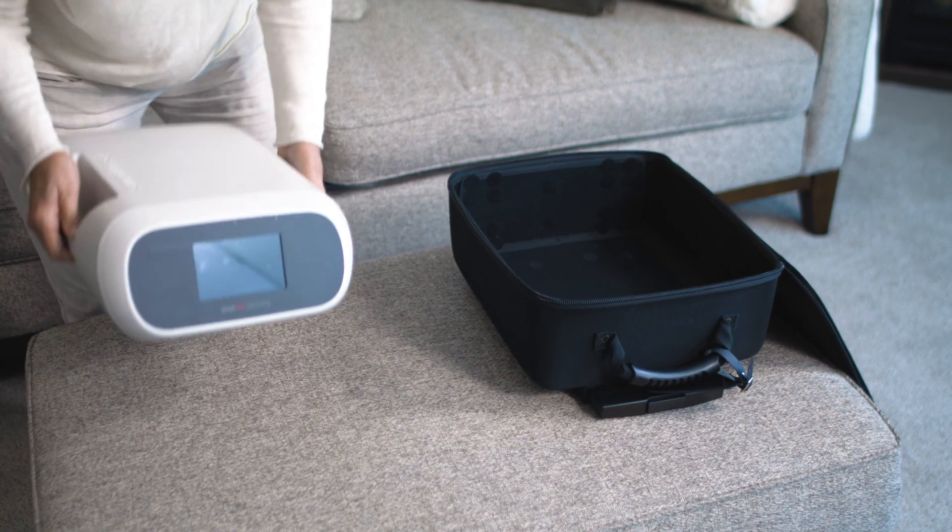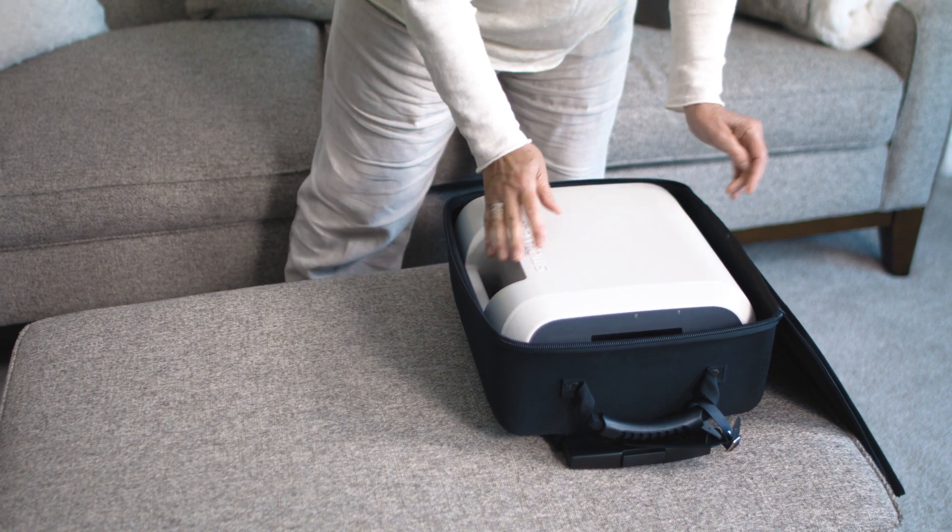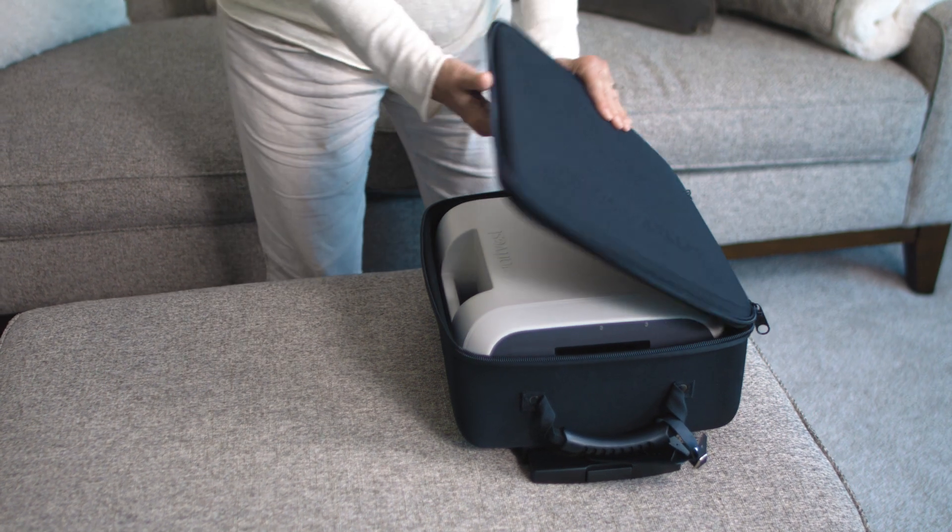Please note that the generator must be removed from the wheeled carrier prior to use, and is designed to support only the weight of the generator. Do not place additional items in the carrier.